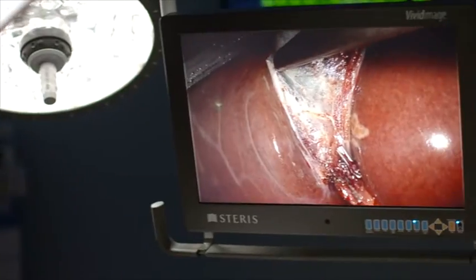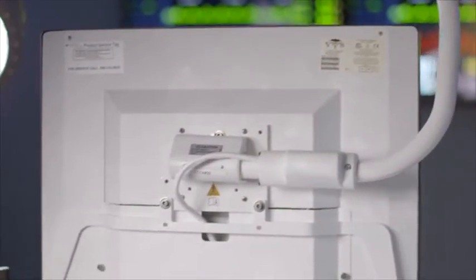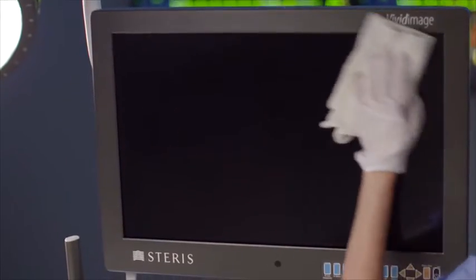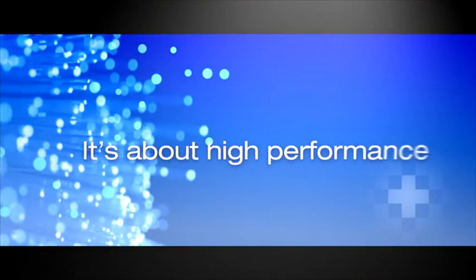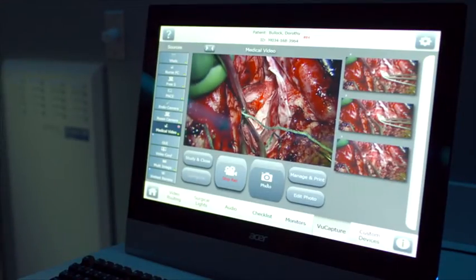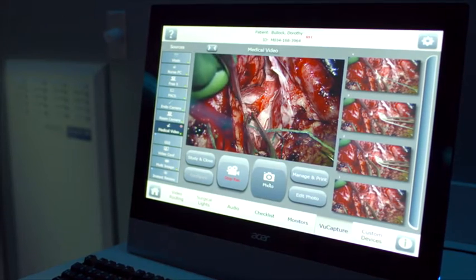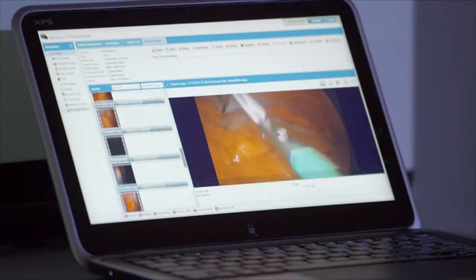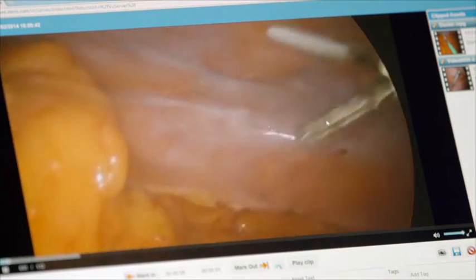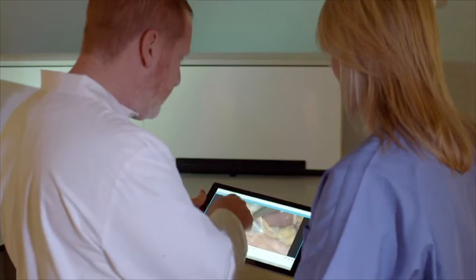Our displays are designed for a clinical environment to reduce cabling, be easy to clean and minimize contamination risk. With Harmony IQ Integration System, you can record any input type in full HD quality, not just the Endo camera. And through our enterprise-rated software, you can securely store, access and share the images and footage you capture and play it back on a laptop or mobile device.